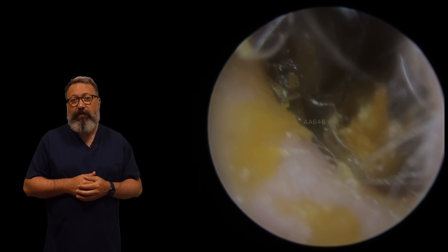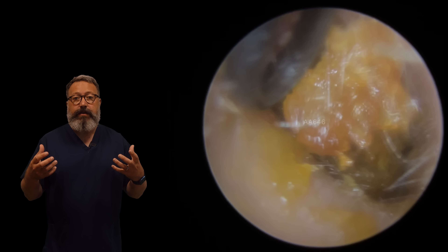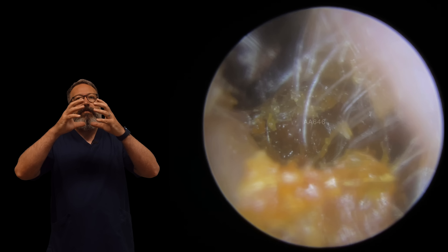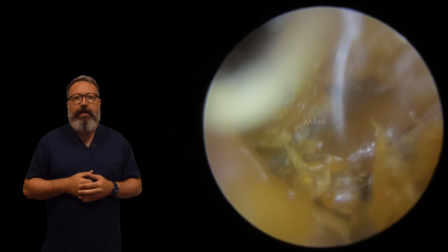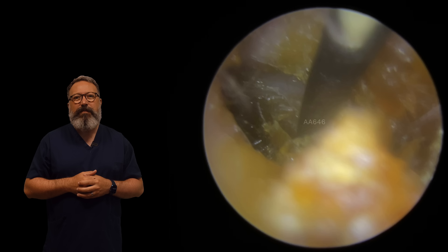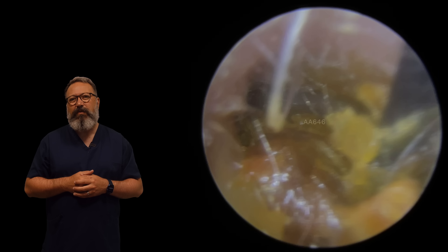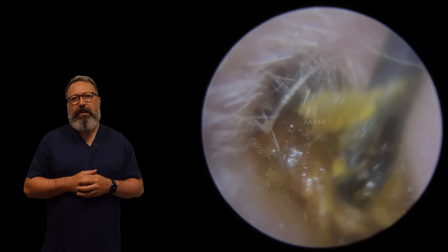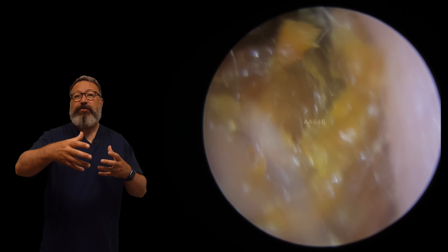What I want you to imagine is going on in this ear canal now is this central plug of wax surrounded by layers like the skin of an onion around the outside edge of it. So it's kind of a tough old job for suction. We're just going in now with the Jobson. You can see just how hard this is. As I'm pulling this, we expect that central plug to come out, but what's happening is it almost rolls down the ear canal.